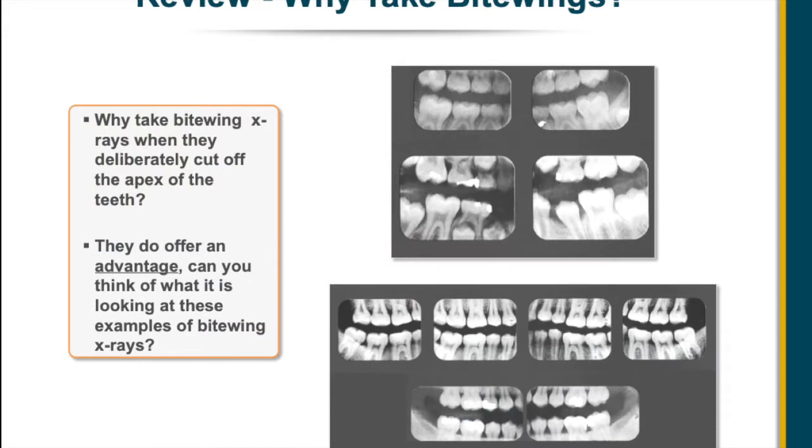Okay, and a little review of why we take bite wings, so that it decreases the number of X-rays that are required. It allows us to open those contacts up really nice and see in between those teeth.